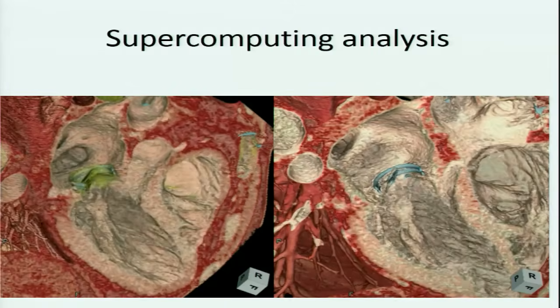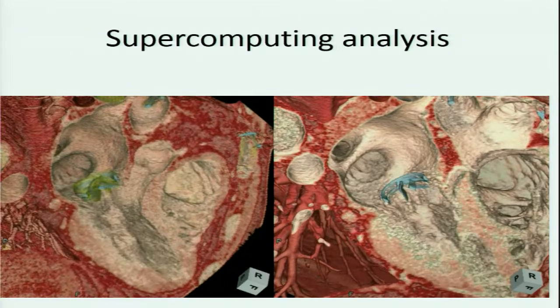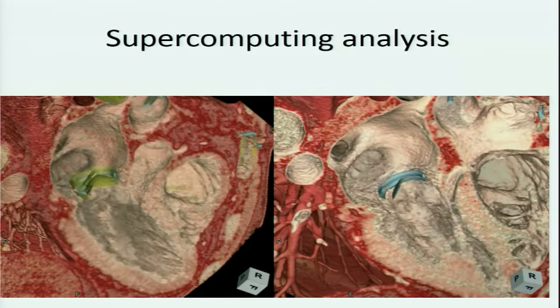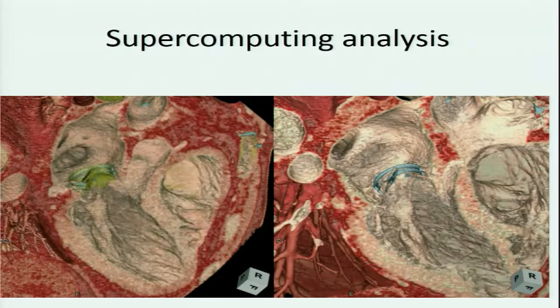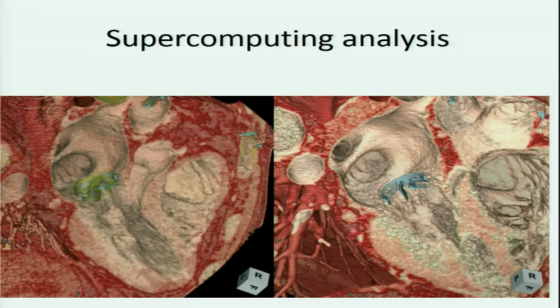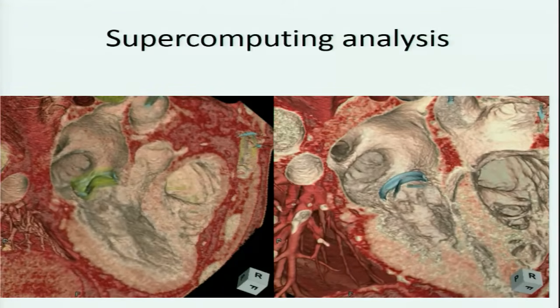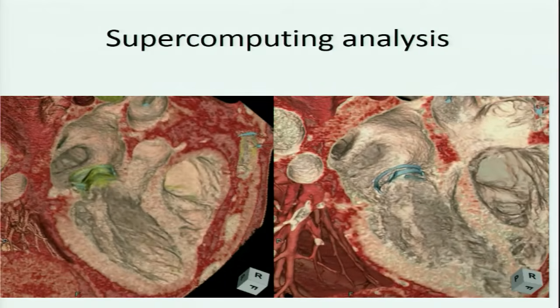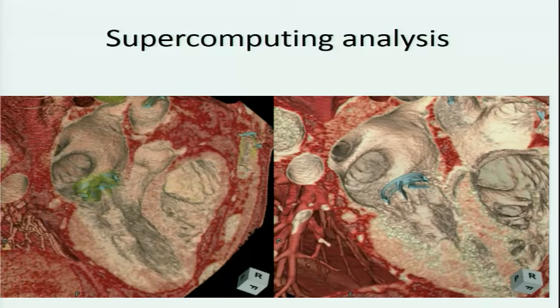by measuring where a certain part of the cardiac structure is at the beginning of systole and diastole, and guessing what the trajectory and the structure would be in different parts of the cardiac cycle. So instead of having 10 or 12 phases per cycle, you can interpolate up to 40 or 50 phases.